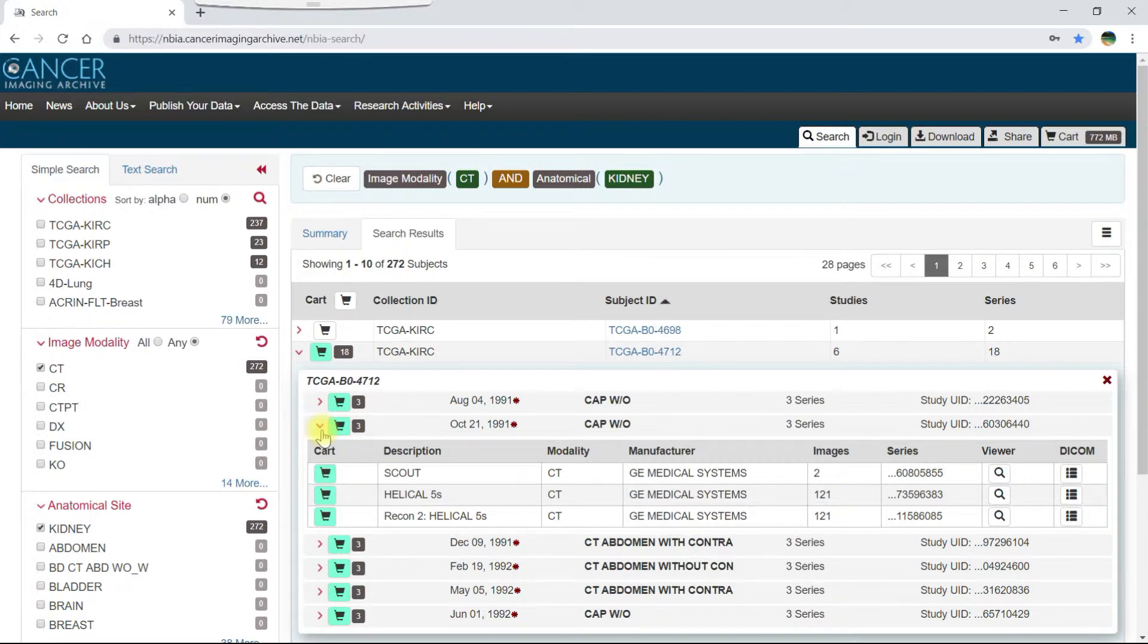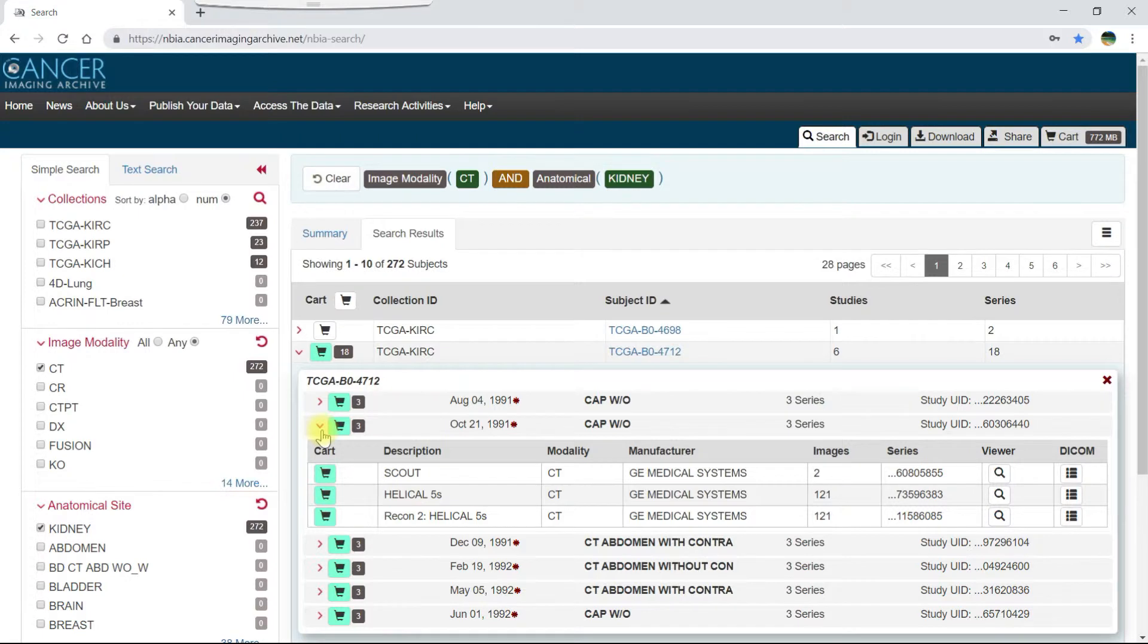Since we selected all data for the subject earlier, the cart icons are green. This means that if you click a cart icon now, you remove it from your cart. Let's remove a scan now.